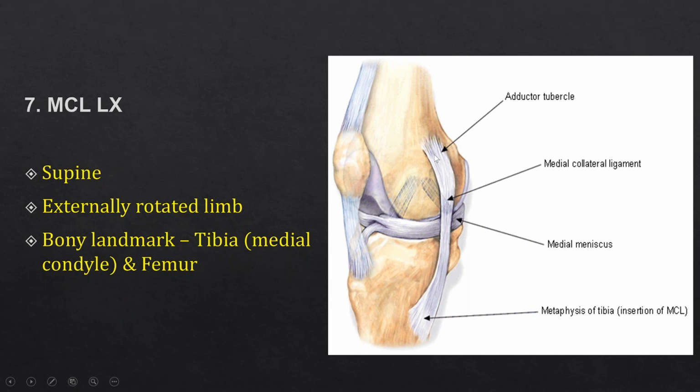So make sure when you do MCL scanning, especially if you're suspecting a strain, sprain, partial tear, or any injury with some valgus mechanism, you scan the whole length of the MCL, because it may be partially torn and the fibers may be retracted up to the very proximal part of the fibers around the adductor tubercle, or maybe on the anteromedial aspect close to the pes tendons. So the fibers can be retracted all the way proximal or distal. So it's important to scan the whole length of the ligament.